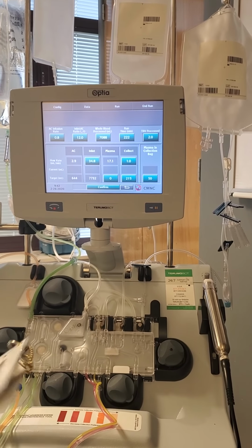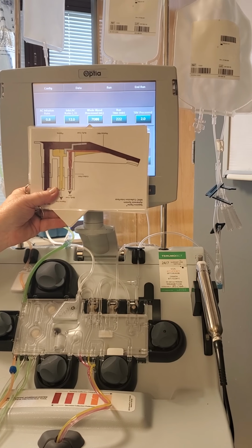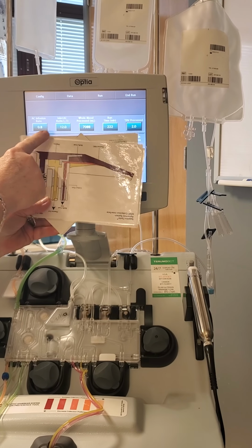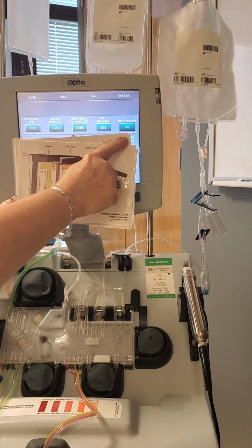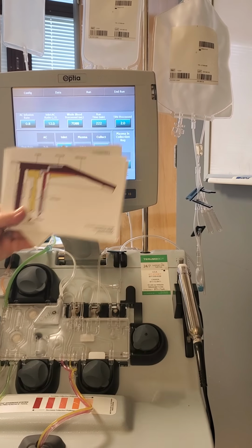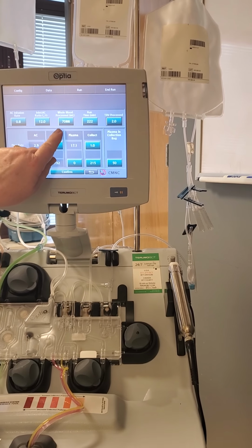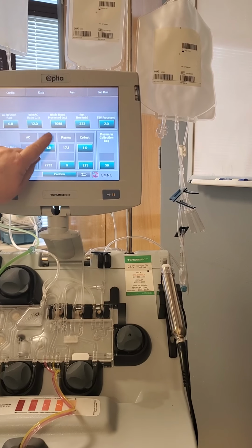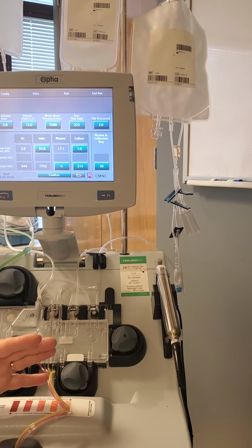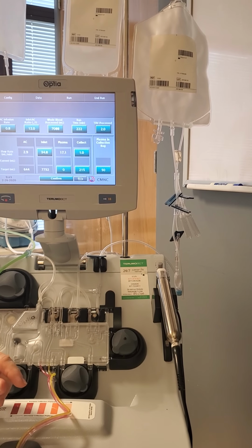The top line of numbers then shows us some additional values that came straight out of our default menu. The AC infusion rate we're going to discuss today, the ratio, and the fact that we're going to process twice your blood volume before the run is over. And your blood volume was 3,500. So twice your blood volume, look, is this value. 7 liters of whole blood is what we have to put through this machine before you're done. Okay? And it's going to take 220 minutes, a little under 4 hours.